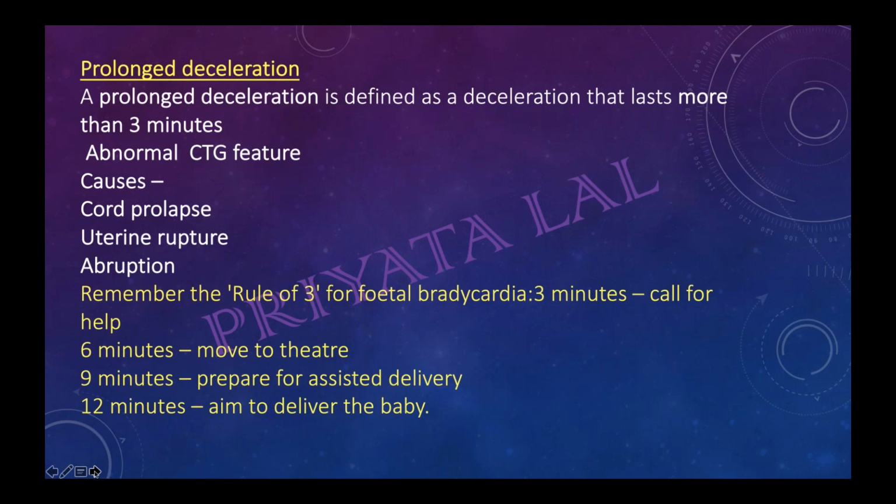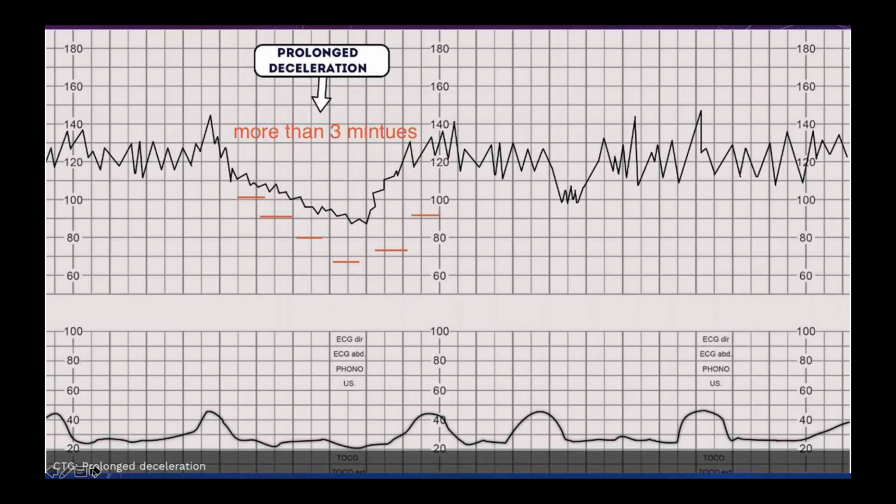This is from the CTG strategy, the rule of 3. So if you get a question, you have to know this. But what you are saying, I will explain that as well. But the rule of 3, if a question comes, you have to remember. Yeah, I will tell that also.